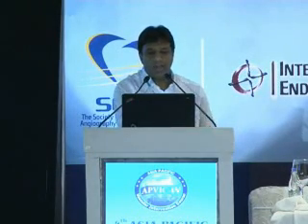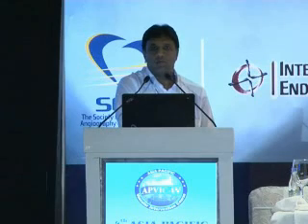All sheaths are packaged with dilators. Dilators serve as an obturator for entry of the sheath and also help to progressively enlarge the tract once guide wire entry has been established. The guiding catheters in the sheath can be used to facilitate passage of a smaller endovascular device through a tortuous curve. They are particularly useful in the renal and carotid system or the contralateral iliac system. These are the different types of catheter according to the need and the use.